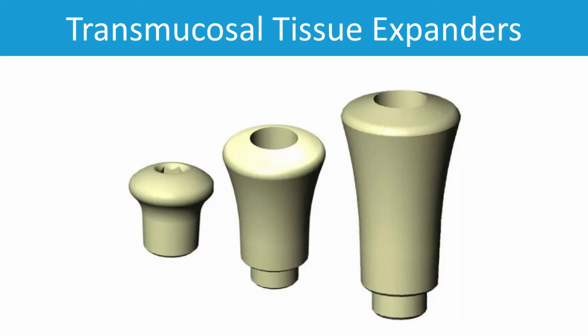The nice thing about these is they push into position, and if there's an issue they just drop out, and then the patient can wait till they see you again, and you might have to use a local anaesthetic to re-expose the implant. But again, that's a rather minor consideration compared to having things loose in the patient's mouth causing damage.